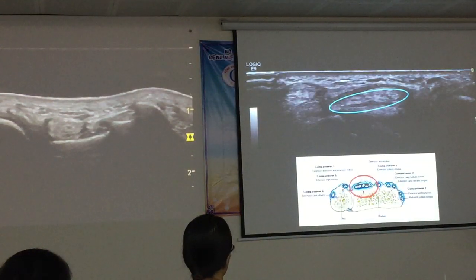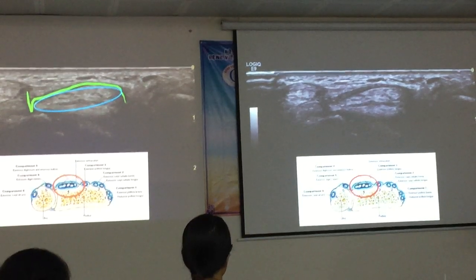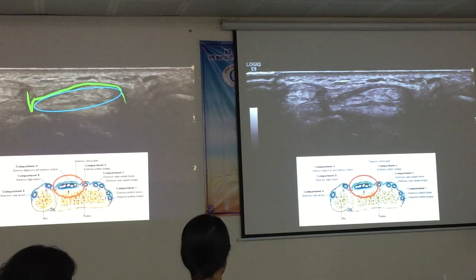So these are the extensor tendons, and we've got the extensor retinaculum that goes over the top of it. Mình sẽ lấy đây là các gân cơ duỗi các ngón và phía trên là cái màng giữ. It's at this location that sometimes this retinaculum looks quite thick, but that is a normal thing to see. Đôi khi thì cái màng chữ này sẽ dày lên, nhưng mà mình cũng phải để nhìn cho quen, để đó là hình ảnh bình thường.